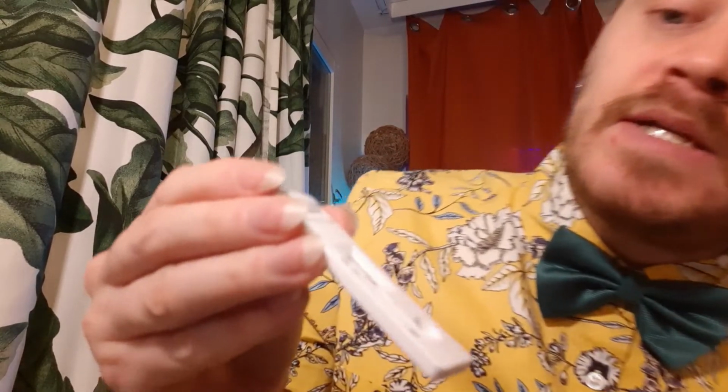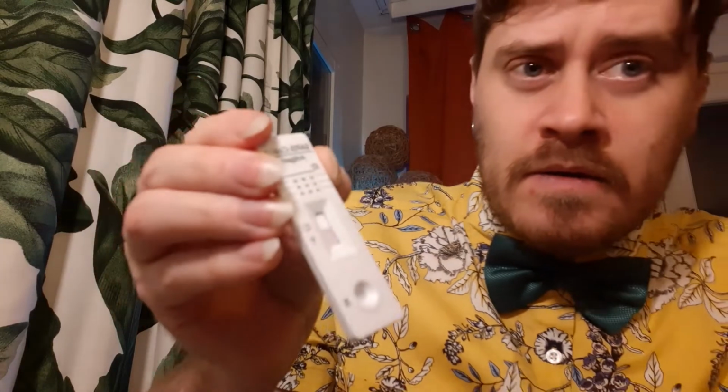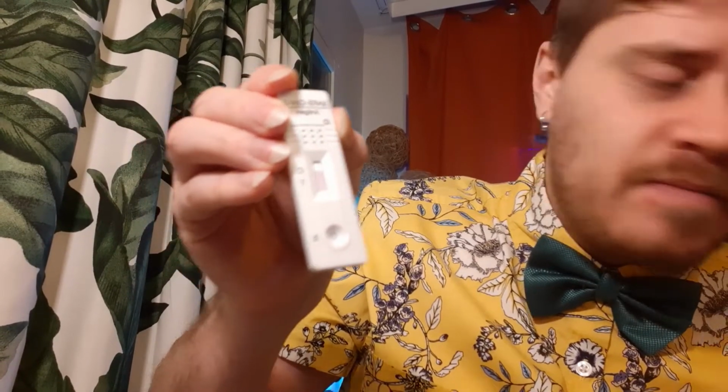Now, you can see it's actually soaking into the center of that. It's soaking up right now. See if I can get that a little clearer. No idea, but you can see that it's coming up. And this is going to be 15 to 20 minutes. So I'm going to set the timer here. We're going to go from there. Yeah, now it's completely soaked through the thing.